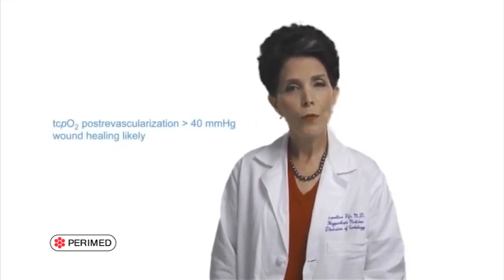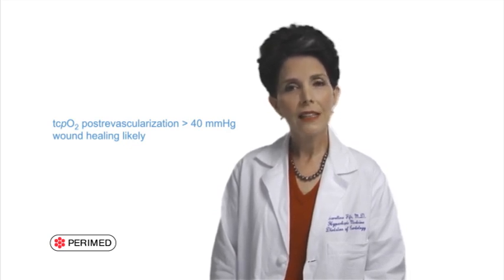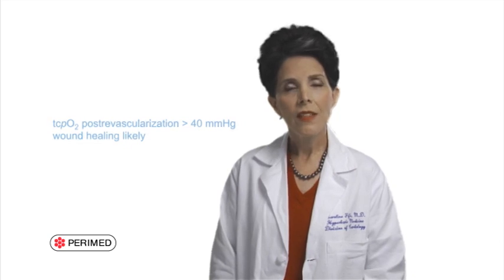If the patient undergoes revascularization and their tcpO2 value breathing normobaric air has then increased to greater than 40 millimeters of mercury after the procedure, they are highly likely to heal. This is true whether the revascularization was done by surgery or endovascular methods.